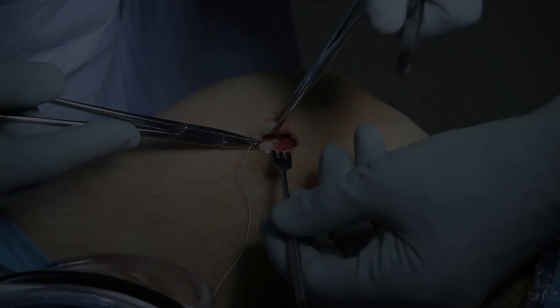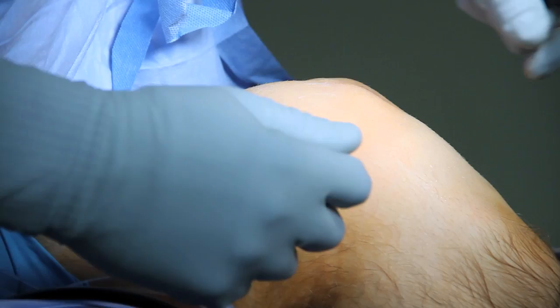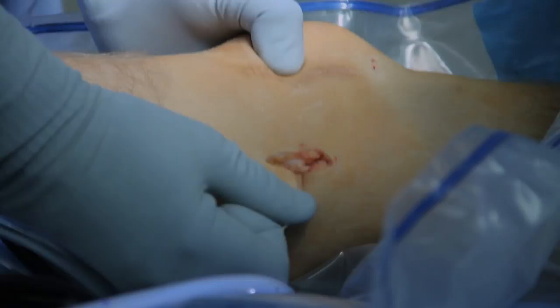Once the medial patella femoral ligament is isolated, a suture is placed into it to pull traction on the ligament and confirm that I can prevent the kneecap from dislocating. By pulling on this stitch, I can prevent the kneecap from dislocating under anesthesia. This confirms the site of the ligament injury and also confirms that by repairing it in this location, it will prevent further dislocations.